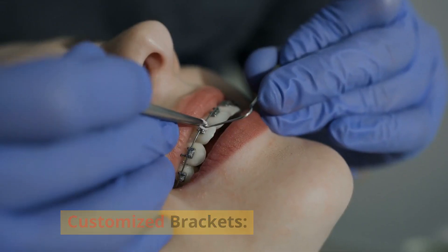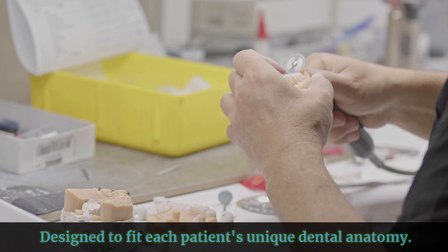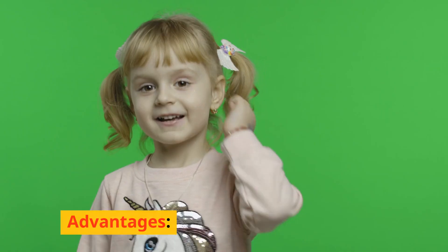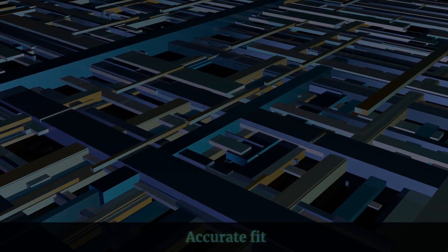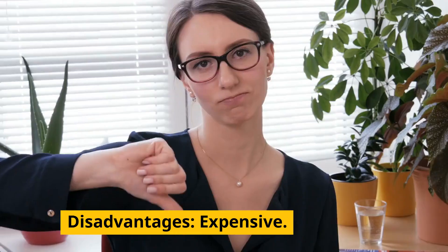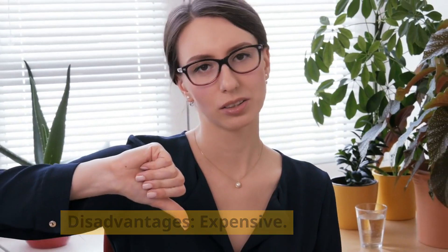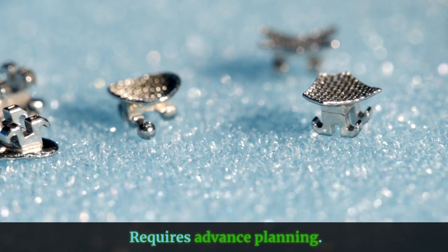Customized brackets are designed to fit each patient's unique dental anatomy. Advantages: accurate fit and optimized treatment outcomes. Disadvantages: expensive and requires advanced planning.